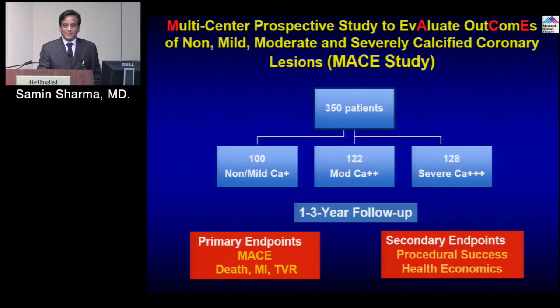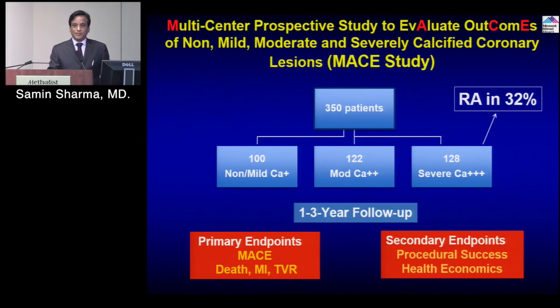Yeah. No, overall, yes. But in a severely calcific lesion, 25%. Just about close, 32%. So just to say that still, that calcific majority of our lesions are being treated by non-atherectomy techniques. So right or wrong, but that is the prevalence, that is how we do.